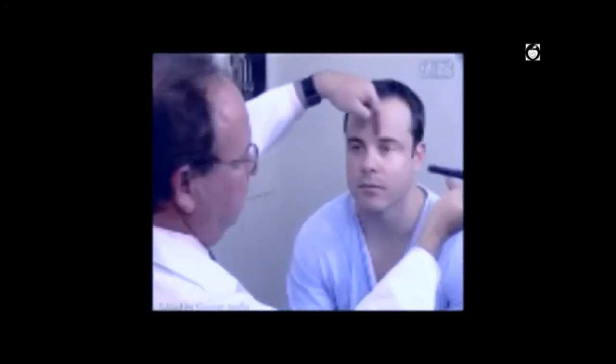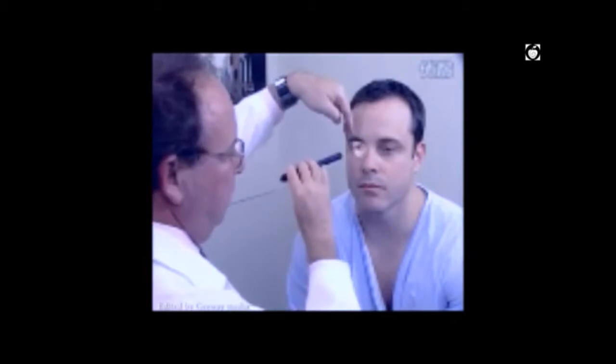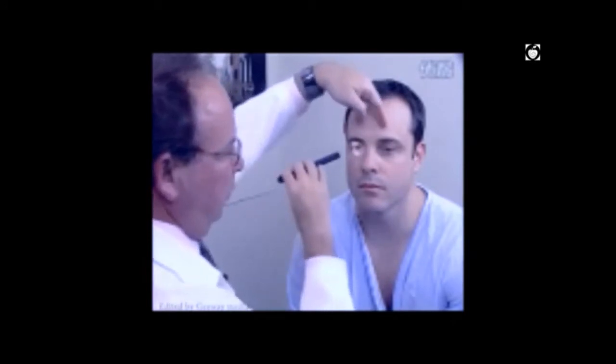To determine eye alignment, ask the patient to look into the distance and shine a penlight straight ahead, noting where the light falls on each cornea. If the light falls directly in the center of both pupils, the eyes are straight. To check pupillary responses, ask the patient to look in the distance as you shine the light from the side — first on the left eye for the direct and consensual pupillary reflexes, then from the other side for the direct on the right and consensual on the left.